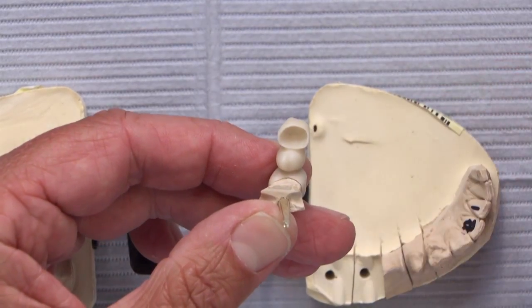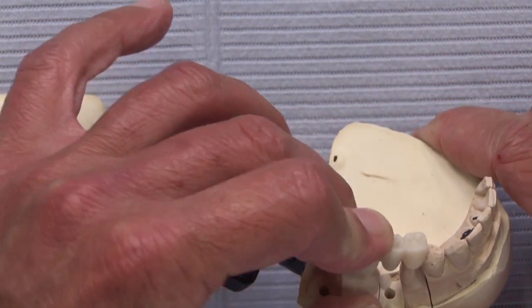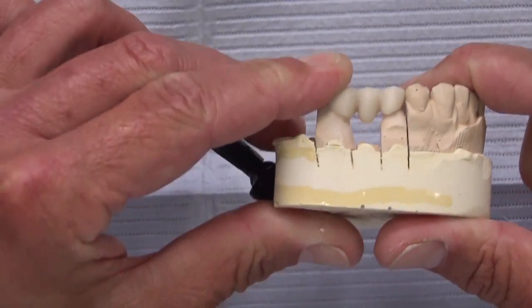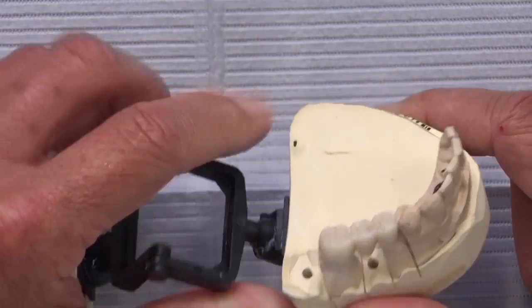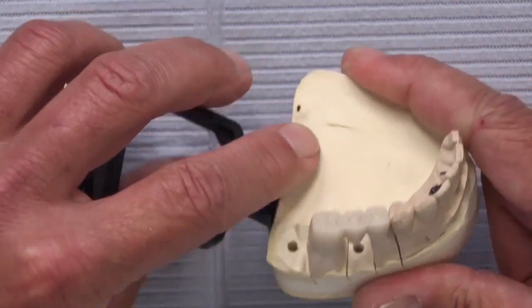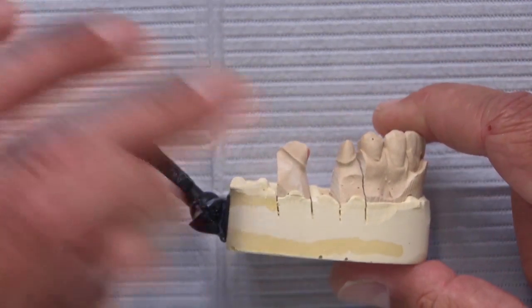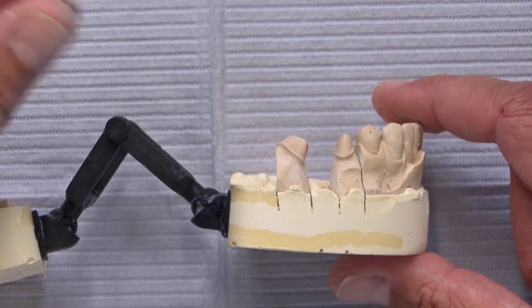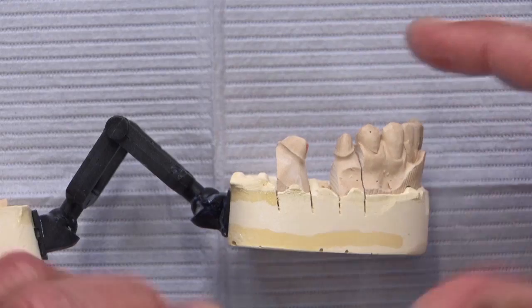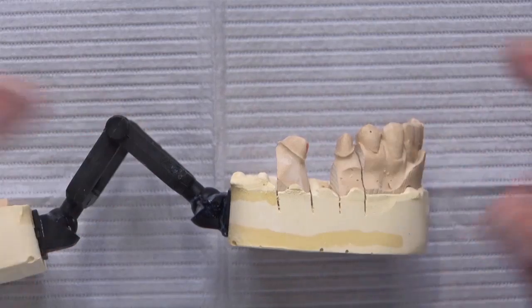If we take out both teeth the Bruxer bridge fits individually — that's not the issue. The issue is as we grind it out you can see how it begins to open the margin. They are done with the grinding and it goes down, but you can see what it does to the margin. Grinding out the inside to change the path of insertion will by definition open that margin. The right way is to go back and prep, and really the best way is to not have this happen in the first place.